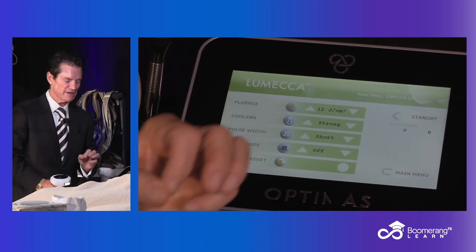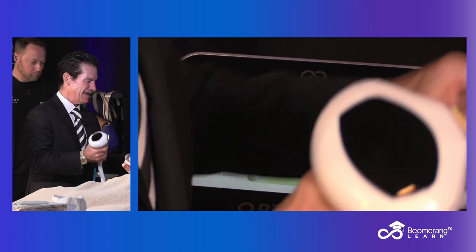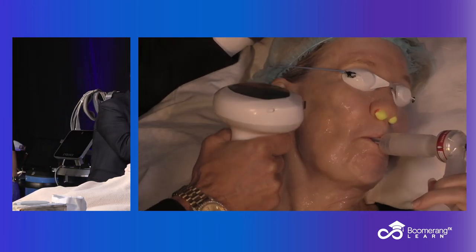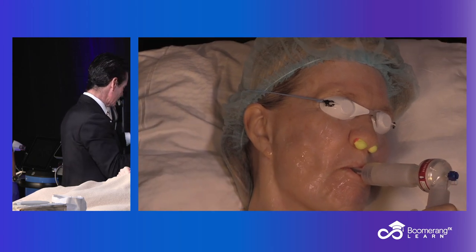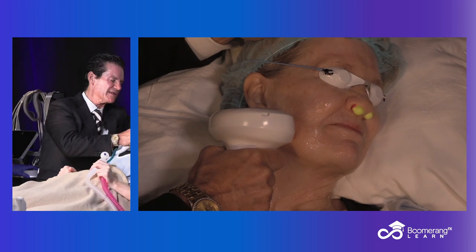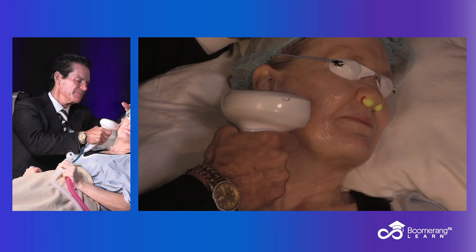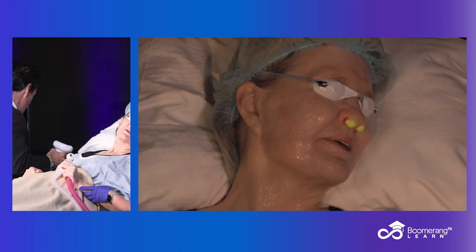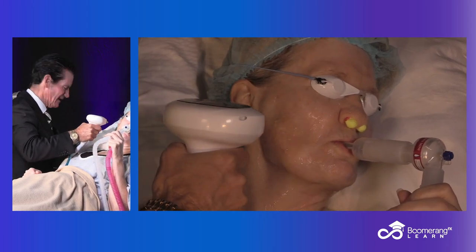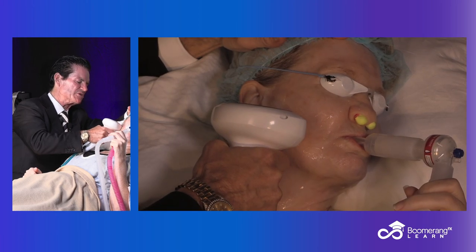We're going to hit the ready button and now I'm going to come in on our young lady here. She can feel free to take a puff of nitrous — she doesn't have to, of course, unless she's a nitrous oxide addict. So I put my finger on the pedal, I'm going to do a little pulse, and I'm going to overlap. Good — if I go to multiple pulse mode, I typically do about 5 or 6 pulses. And I make sure that there's some erythema and edema, but no epidermolysis — that means a blister.